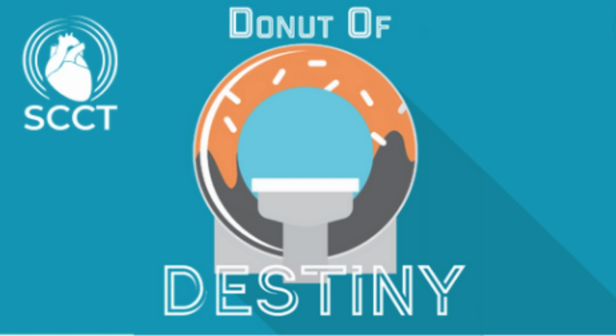If you go with systolic imaging and you don't need beta blockers anymore, your throughput increases. So especially for new centers that are trying cardiac CT, that can be really helpful to keep the demand that it puts on the system to a minimum and to have some efficiency out of it.